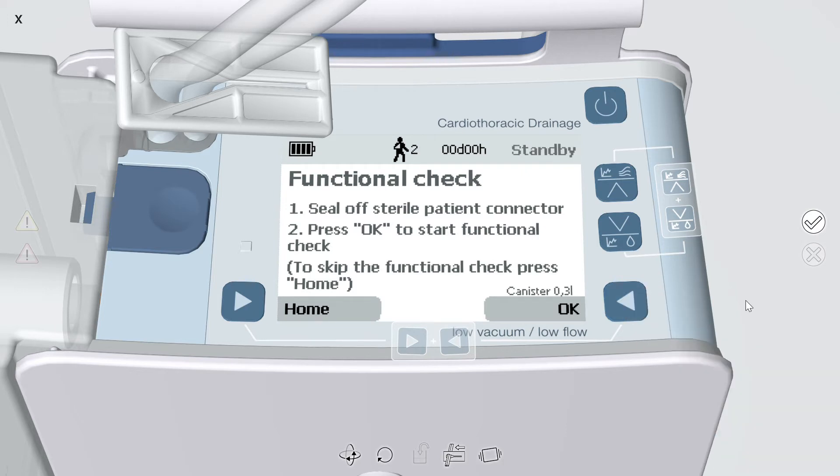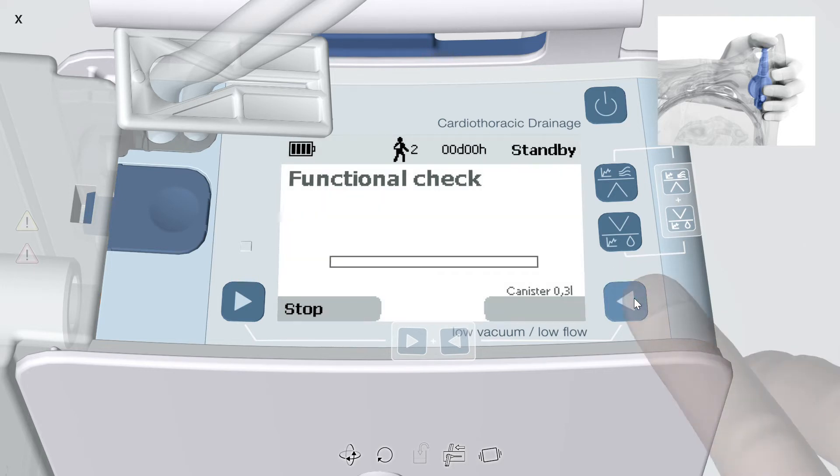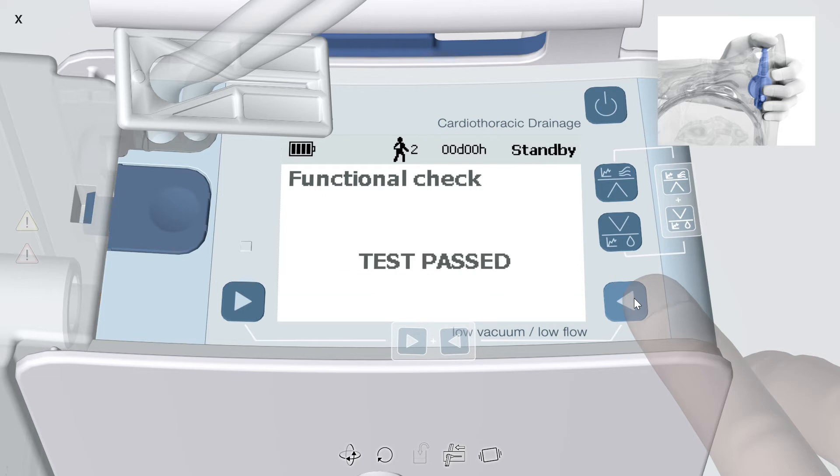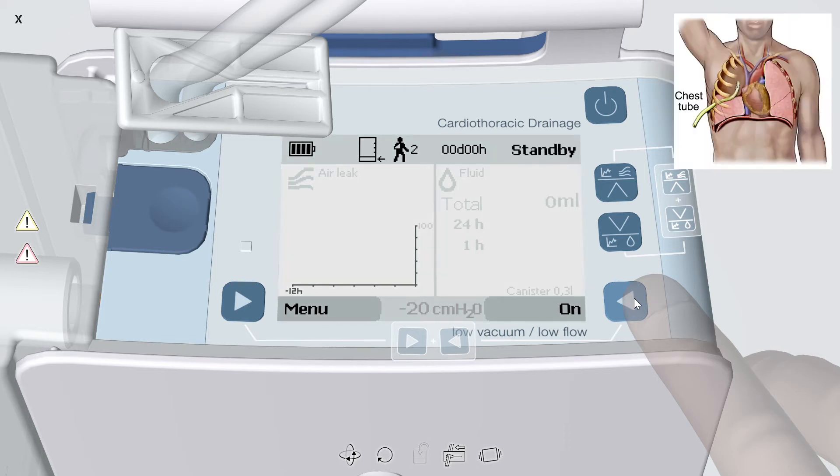To complete the functional check, occlude the patient connector end of the Topaz tubing using aseptic technique and press OK. After the functional check, the display should show test passed. If test failed appears, reassemble the device and run the functional check again. Once the test is passed, the patient connector end of the Topaz tubing can be inserted into the patient's chest tube or tubes.